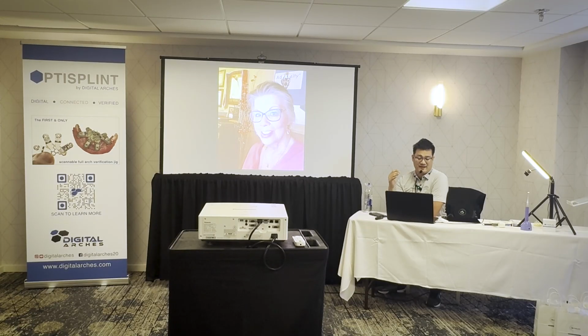So one option is that if I had to do a correction, if it's a small amount, I could potentially do a correction bake with a low fusing structure, maybe, right? Or I would just remake it. But I don't really know.